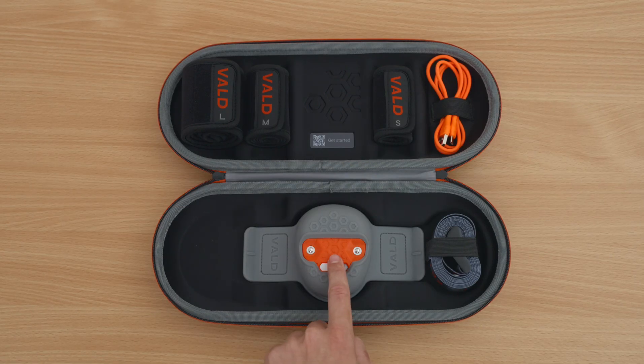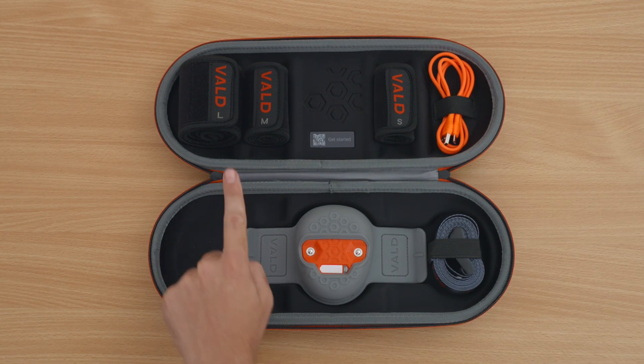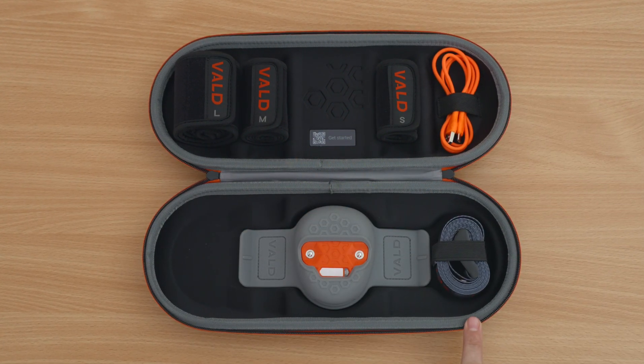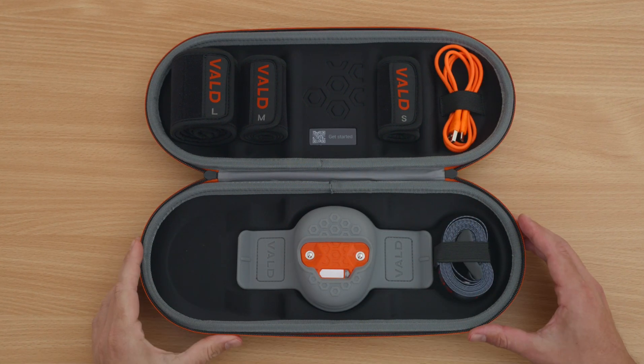Your kit contains a Dynamo Lite unit, silicon pouch, three limb straps, adjustable strength strap, USB-C cable, and a convenient carrying case.